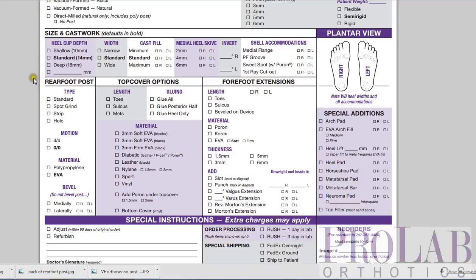Here we have the rear foot post section of the form. We see we have four parts of it: the type of post, the motion of the post, the material, and the bevel.